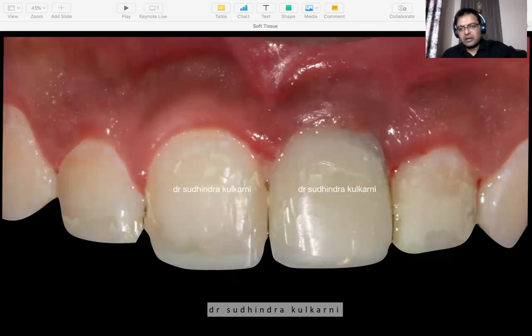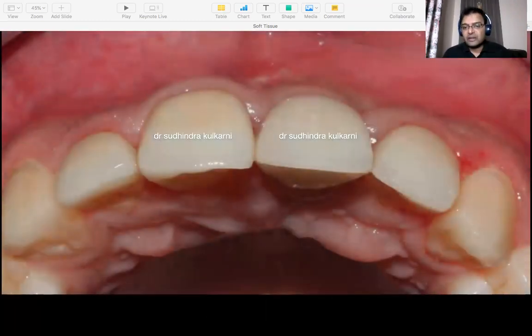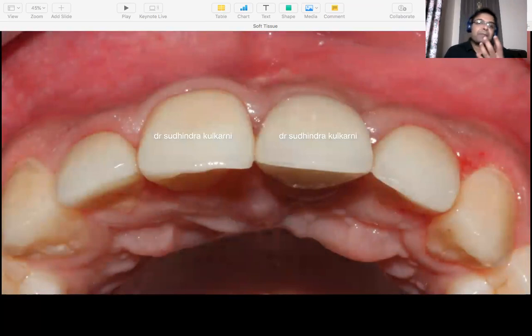Now, what I see here around the 2-1 is basically a reactive hyperinflammatory tissue, okay, around the under contoured 2-1 crown. Okay, now it looks my tissue is good. I then keep on under contouring it a little bit more so that the tissue starts settling well. So there's no graft done here. What we did was we played with the tissue to give the kind of outcome that we wanted.